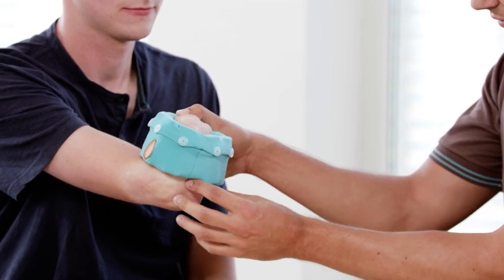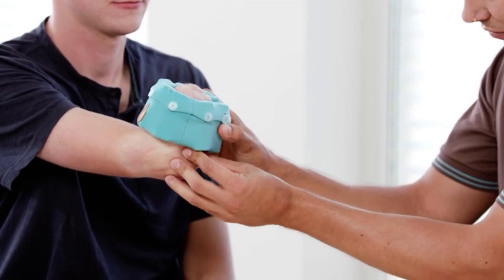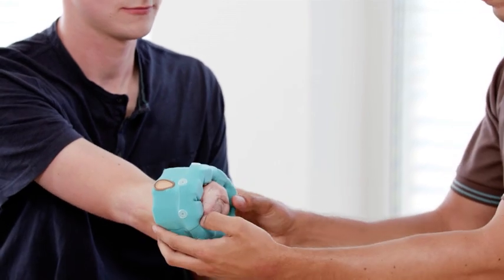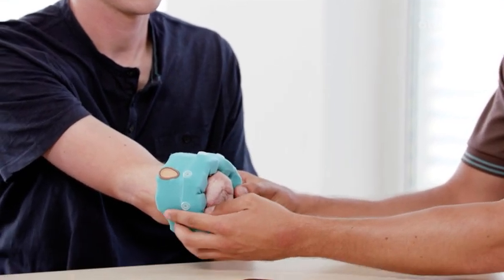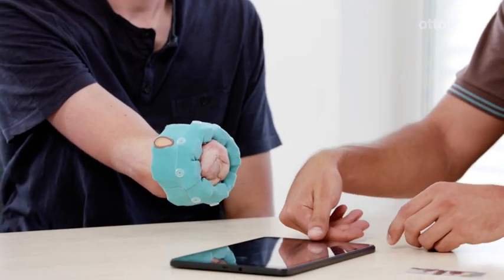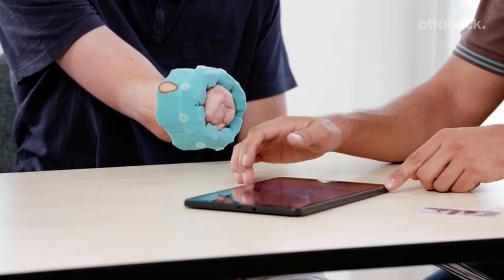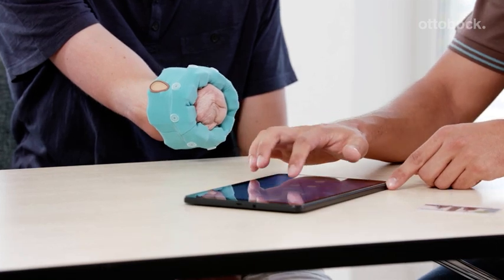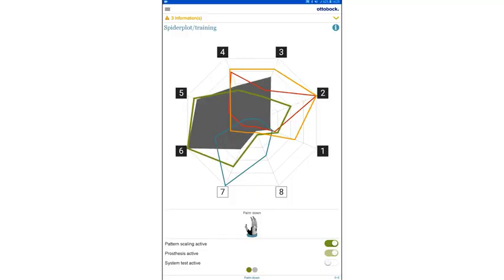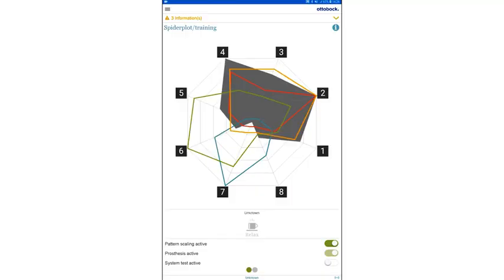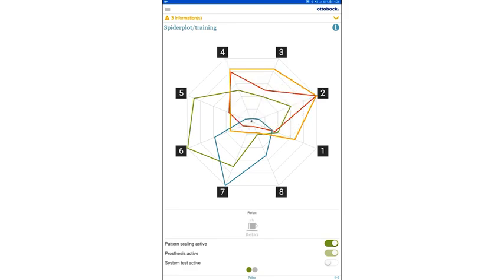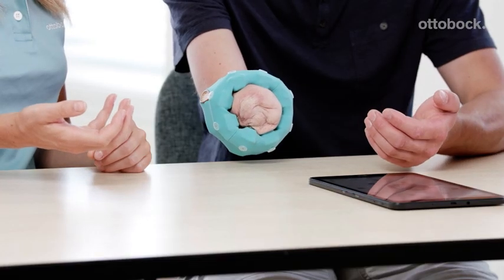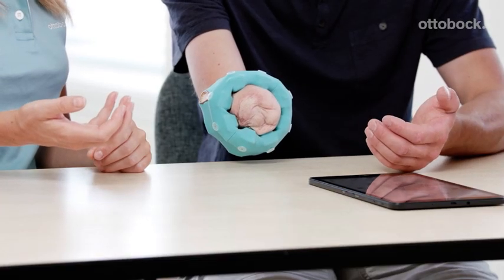The Myo Cuff, a flexible electrode cuff that is applied quickly and easily, is used to determine if Myo Plus is suitable for the user. This step-by-step guide shows how the Myo Cuff and the Myo Plus app are set up to evaluate the user's individual movement patterns.